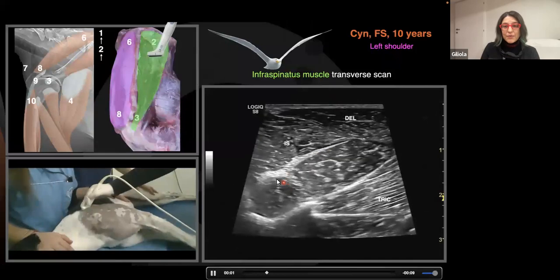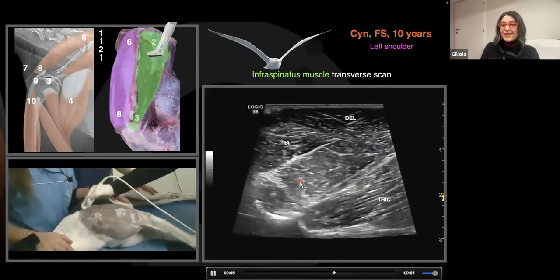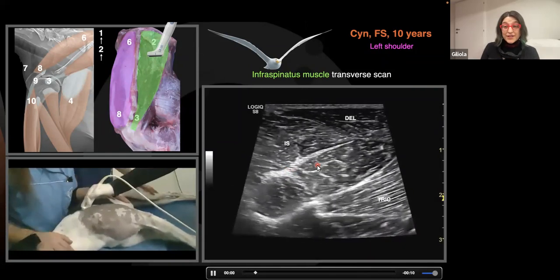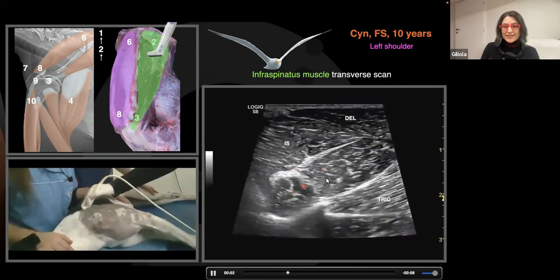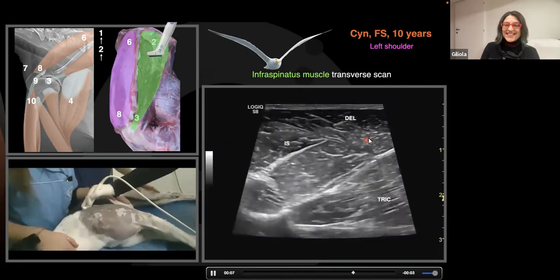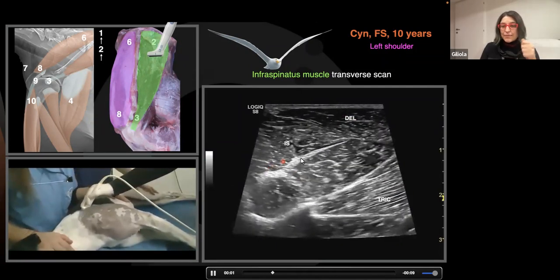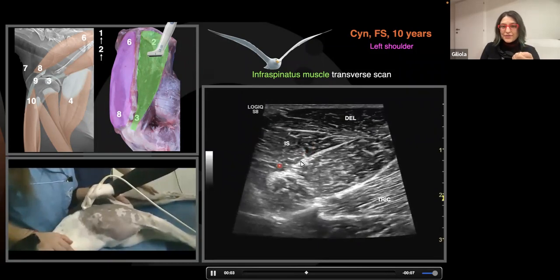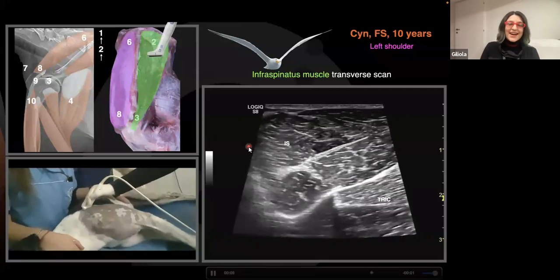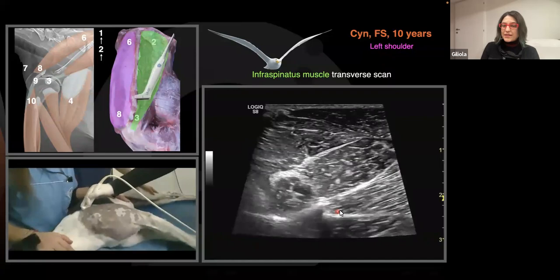And this is our seagull muscle. This is the infraspinatus. The good news is that every single muscle is different. After a while, you recognize them by name. They are very nice. I hope my muscles are like that, but I strongly doubt it. This is the deltoideus. This is the triceps muscle. I have a fantastic probe where you put the probe and you have the name of the muscle. No, but I wish.